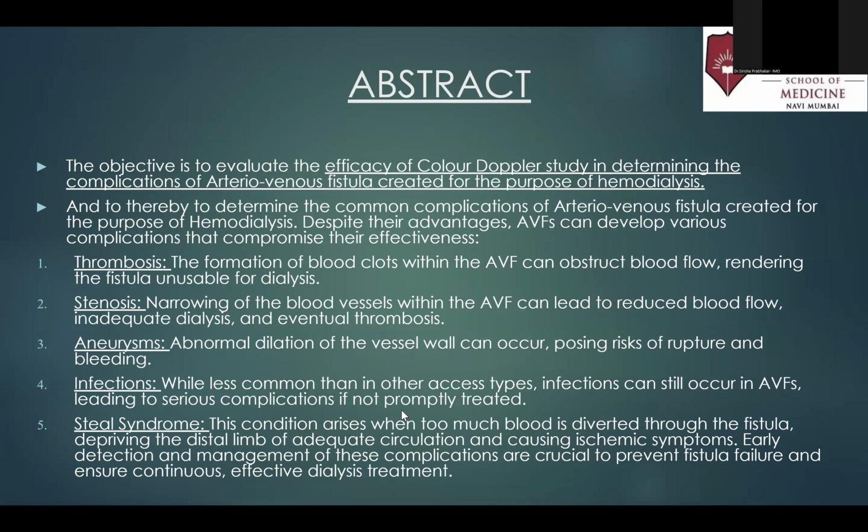Let me outline 5 main complications we encounter in patients with AV fistulas created for the purpose of hemodialysis. First, thrombosis, where there is formation of blood clots within the AV fistula that obstruct the blood flow, rendering the fistula unusable for dialysis. Second is stenosis, where there is narrowing of the blood vessels within the AV fistula, which can cause reduced blood flow, inadequate dialysis, and eventual thrombosis.